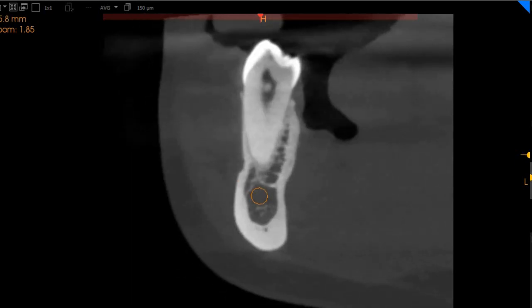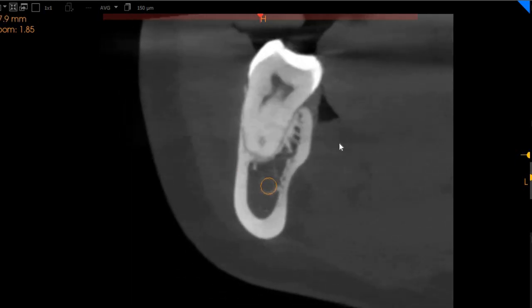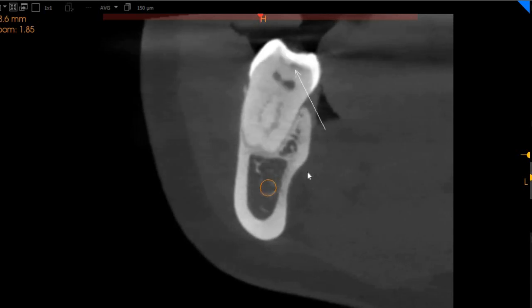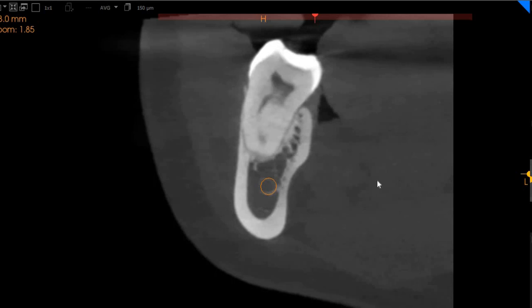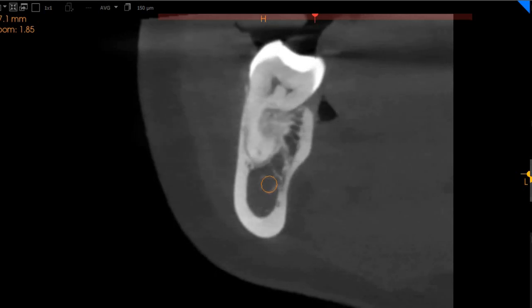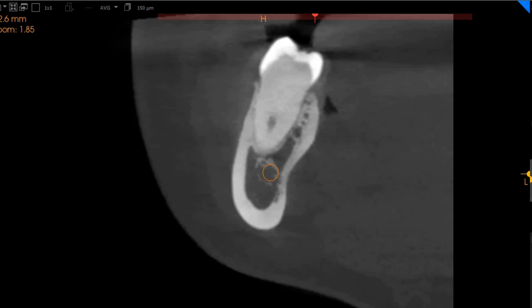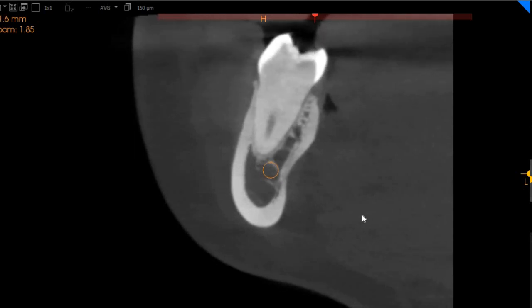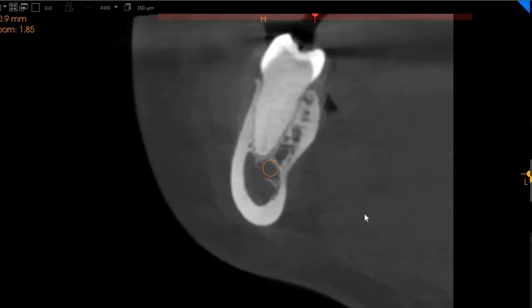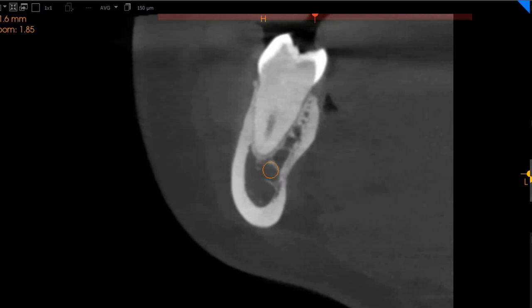Moving to the lower right 6, we have a slight carious lesion right here, but not enough to cause pulpal involvement. We have the distal root right here with a single canal all the way down and low radiolucency. We can't identify anything significantly problematic with the 6s.